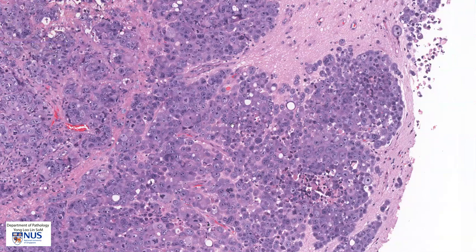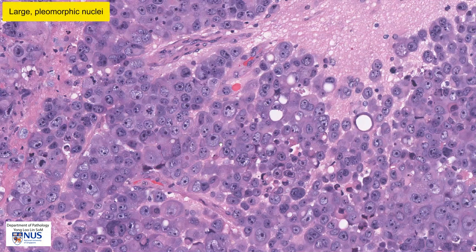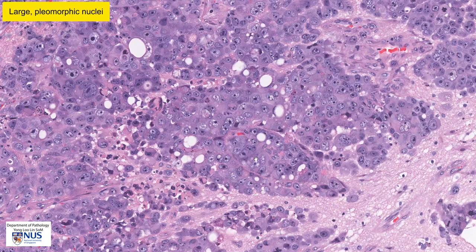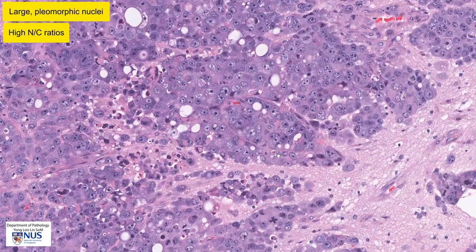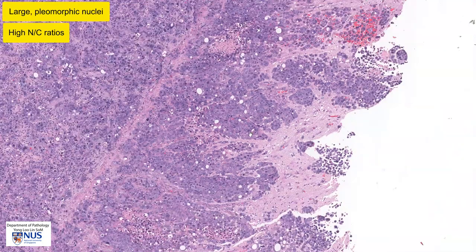Looking at the individual cells, we can see that the nuclei are very large. They are very pleomorphic — there's a lot of variation in size and shape between different cells. For example, this nucleus is very large compared to this one, which is much smaller. The NC ratios, or nuclear cytoplasmic ratios, appear to be relatively high, with many of the cells containing just a small amount of cytoplasm. This contributes to the blue appearance overall on low magnification, because the nucleus occupies so much of the cell.